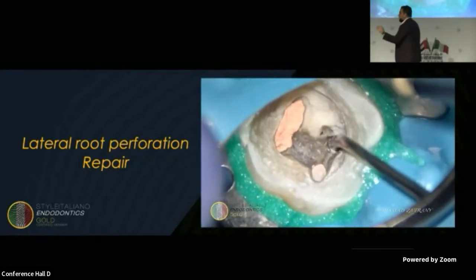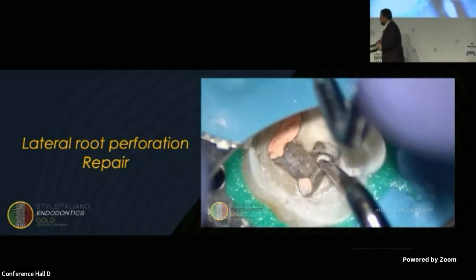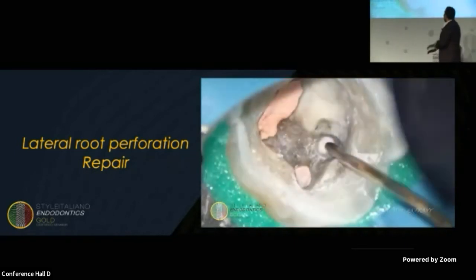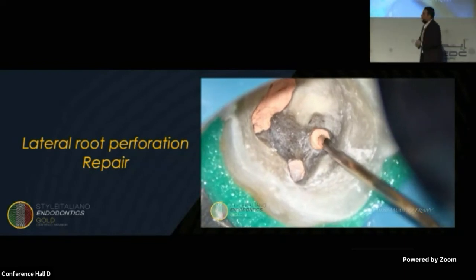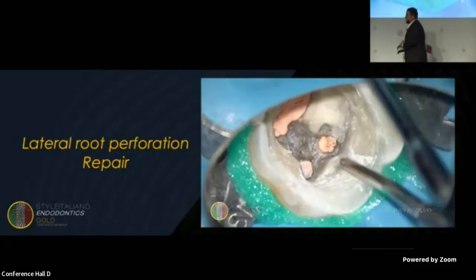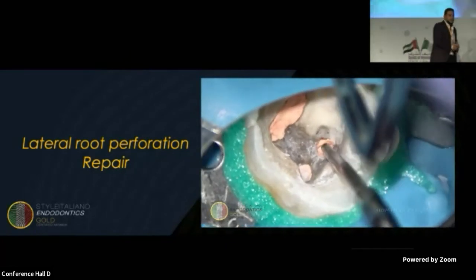It has a different consistency to use for this kind of repair, right? Now, backfilling using warm Gutta-percha. Compaction. This is a sandwich technique.